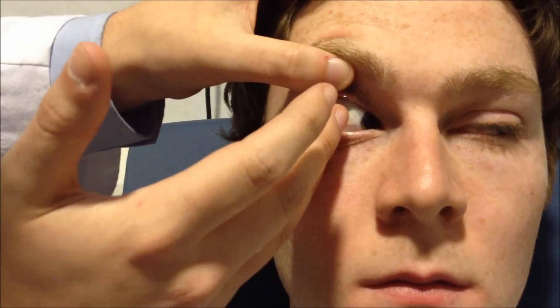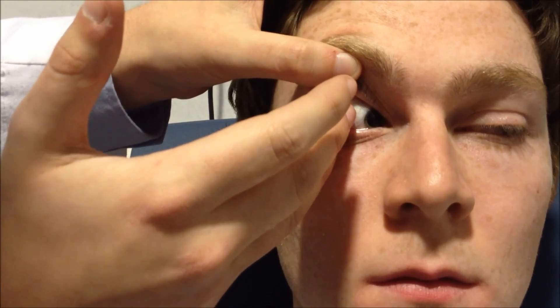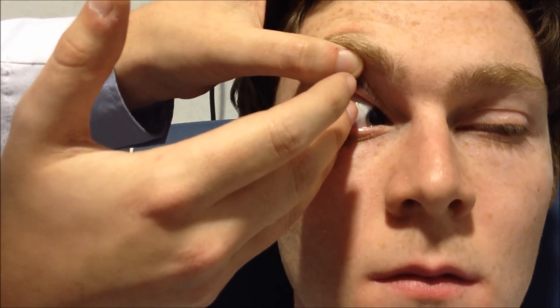Look straight ahead for me, Sean, and look in towards your nose. Then what you want to do is just insert it right onto the sclera — that gives you a nice big wide-angle view. That's great. Let it settle, bring your finger away.